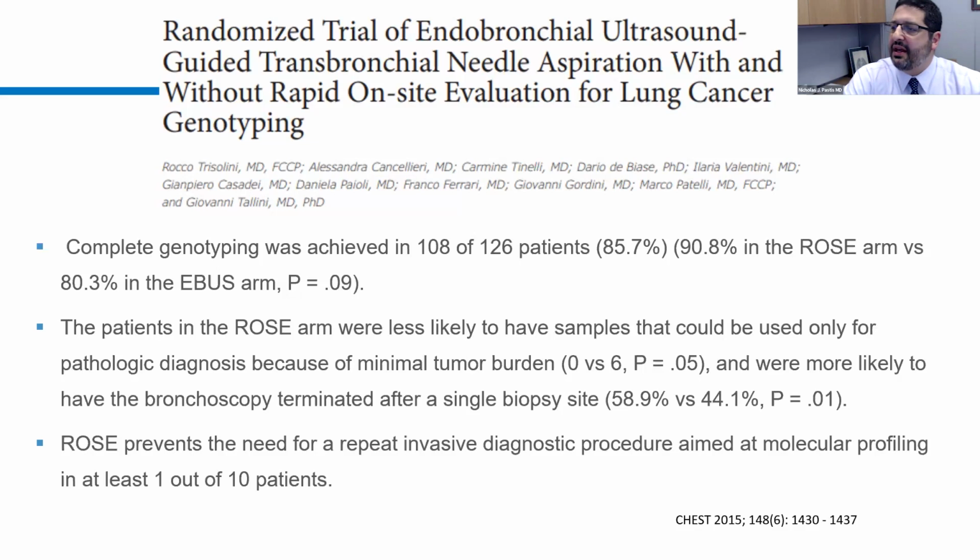So this is a randomized trial of EBUS TBNA with and without rapid on-site evaluation for lung cancer genotyping.